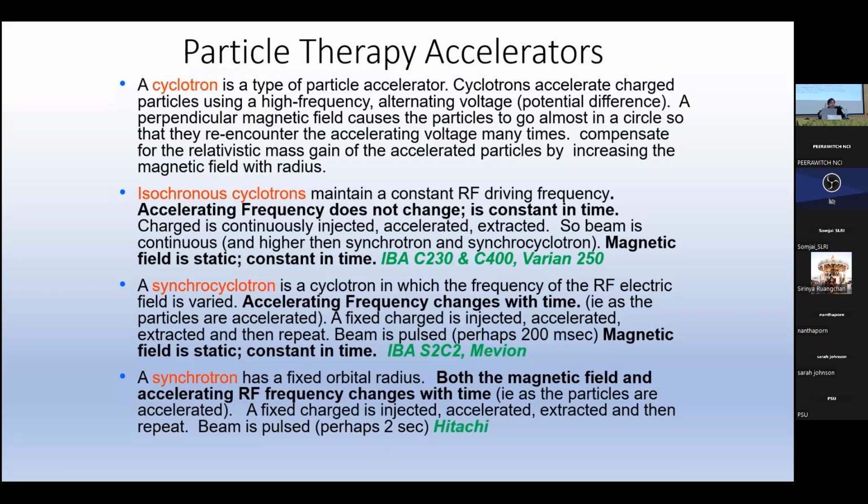All right, so that gives you a sense of the scale. So what do we use in proton therapy? I'm not going to talk about some of the more exotic things that people have proposed. I'm going to focus on the mainstay, cyclotrons and synchrotrons. When I talk about the vendors, I'm not too sure which lecture that is, that might be the 5th or 6th lecture, I'll talk about some of the ones that are using other accelerators like linacs, etc. But primarily, most are either a cyclotron or a synchrotron.